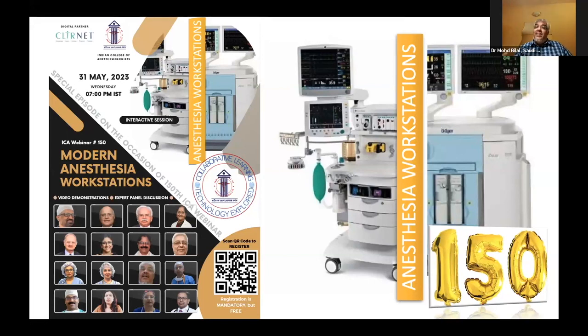Screwdrivers, knives, scissors, all this should be left outside. Your pager, your mobile. Pager was the older time. The mobiles, your watch. One day I put the watch and went inside. It was 5-6 hours I had gone through. I see the watch is the same time. Time also doesn't change. So these things don't work in the MRI environment. So if you take care and keep things safe, it is really safe. And I think it will work out.